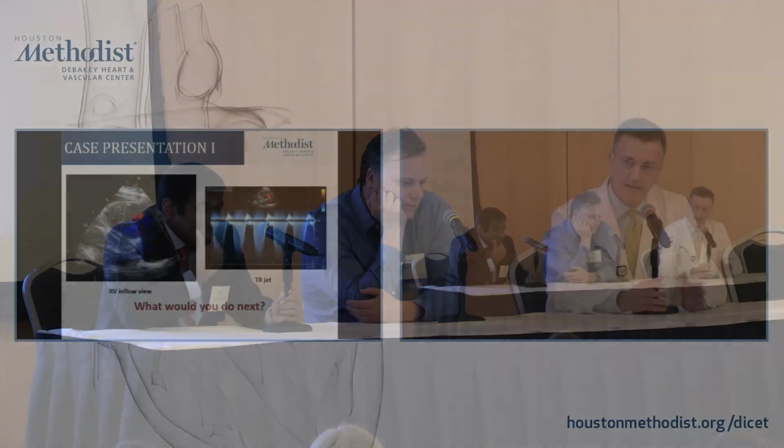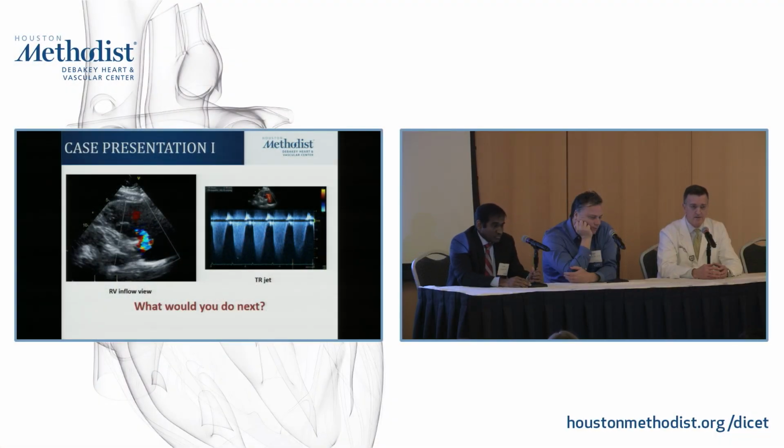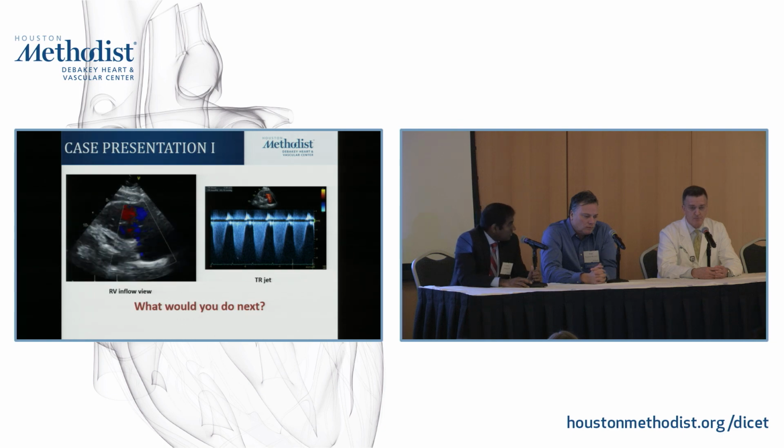I think a common misconception that many people have is that ECMO, either peripheral or central, decompresses the heart, and it doesn't. It really just allows circulation in the systemic circulation. And if you look at pressure volume loops, they really don't change on ECMO. So if you have a compromised dilated ventricle that is not from acidosis or poor perfusion, you may not get good decompression of the right or left ventricle, and you also won't get good recovery of the right or left ventricle. It's a good way to keep the patient alive. It's not necessarily a good way to get the ventricles to recover unless you do something differently, like decompress them.